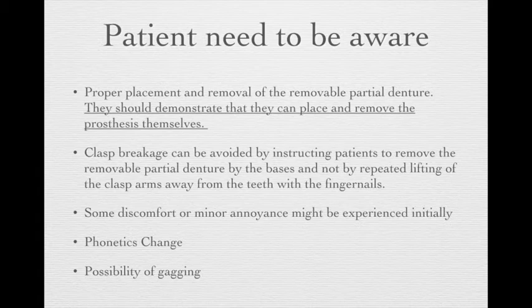So their tongue and soft tissue are already used to being without the tooth and without an appliance. Right now, it seems like you put something new in the mouth all of a sudden, so they will definitely feel some minor discomfort. That's pretty common. You have to make the patient aware, because that's why we need to have a follow-up treatment.